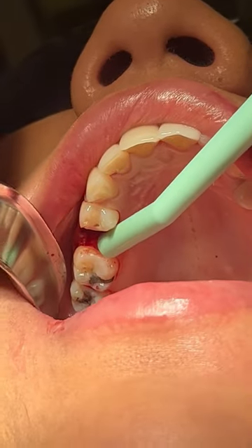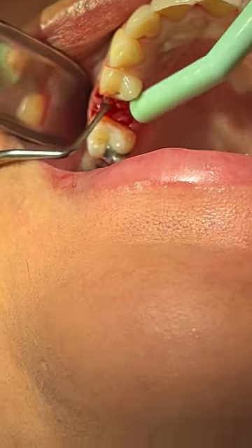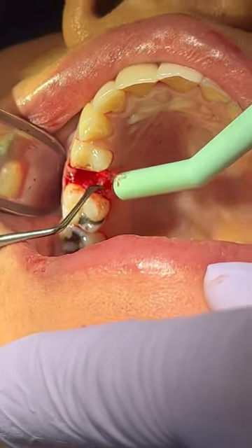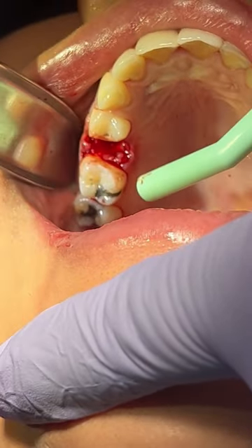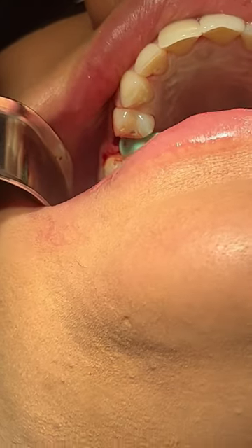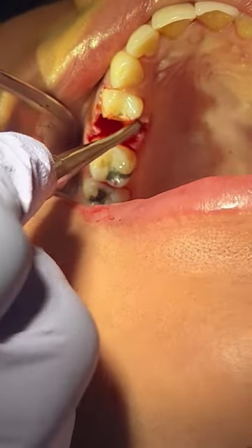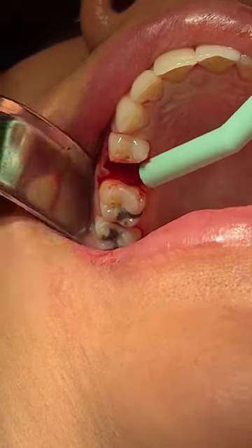That's perfect right there — that's exactly how it's supposed to be. Now you'll see the serrated curettes. I get these serrated curettes; they're wonderful for getting rid of granulation tissue. These serrated curettes are amazing for getting rid of granulation tissue — if you want to know where I got them, please let me know. I also use them sometimes to elevate the soft tissue a little more. I know that's not what they're meant for, but it works for me. Whatever you can do with any instrument you have, absolutely do that. I'm going back in because I noticed my lingual tissue was not elevated enough, so I'll go back with a periosteal elevator.